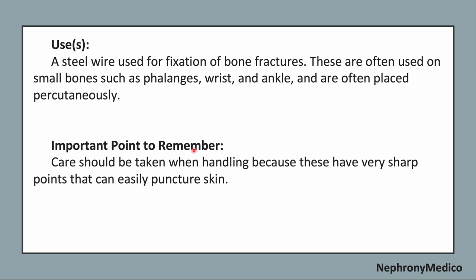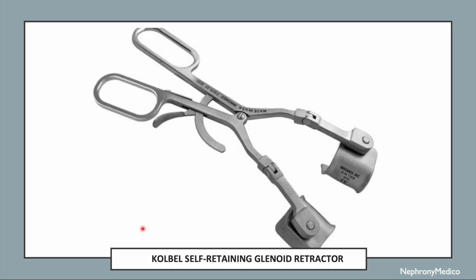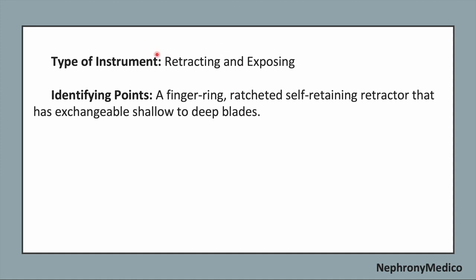Now, important point to remember. Care should be taken when handling because these are very sharp points that can easily puncture the skin. Let's talk about Kolbel self-retaining glenoid retractor. This is a picture showing Kolbel self-retaining glenoid retractor. It is a retracting and exposing type of instrument.